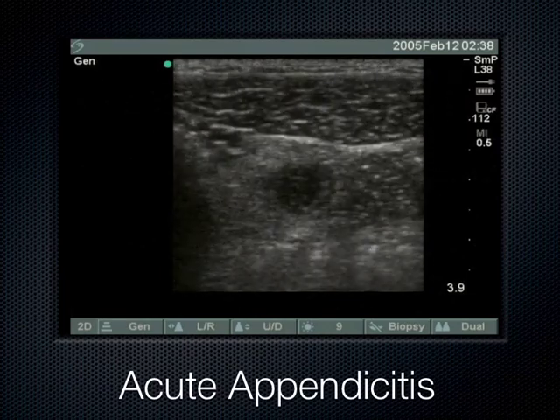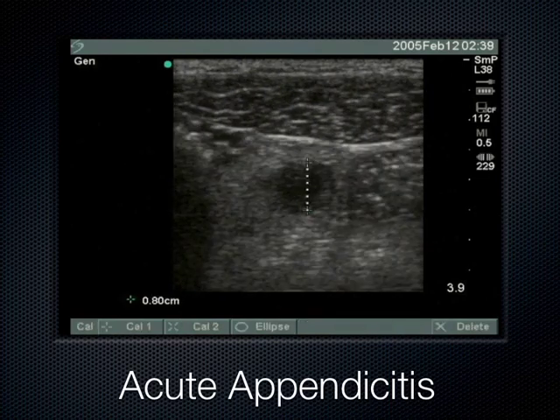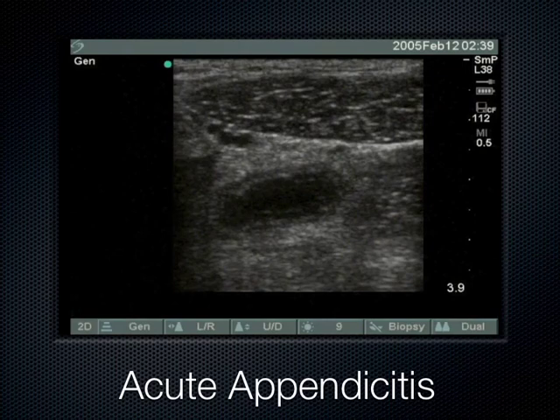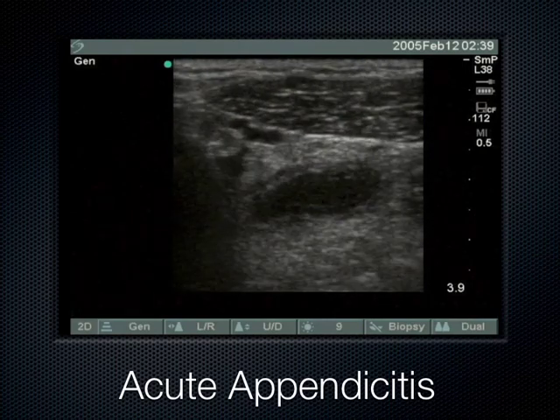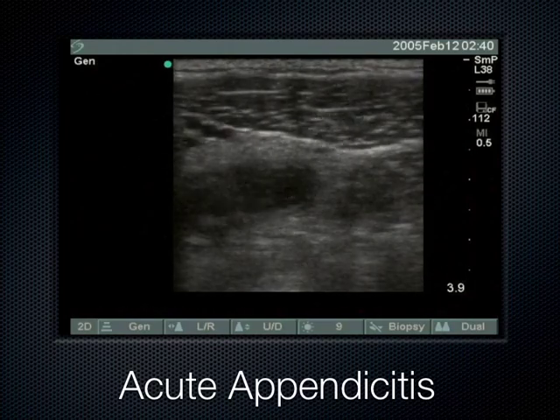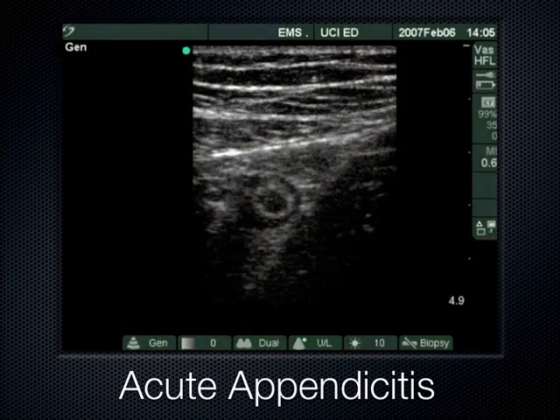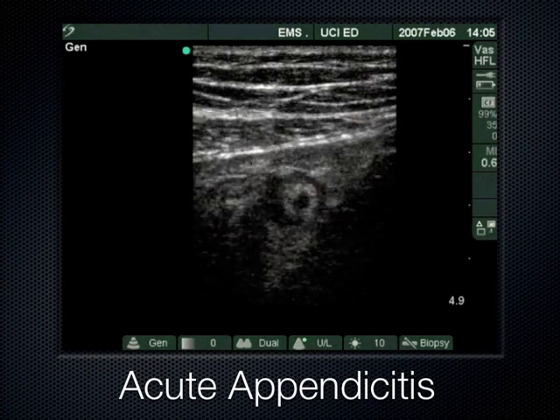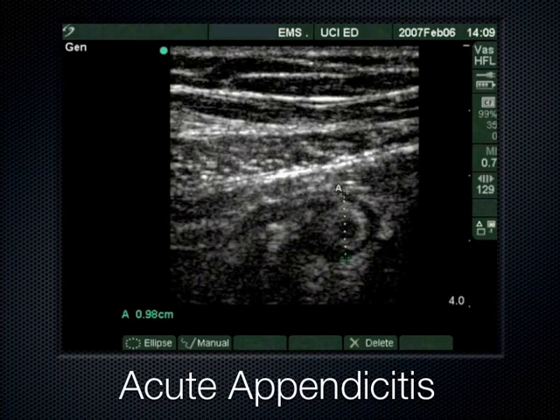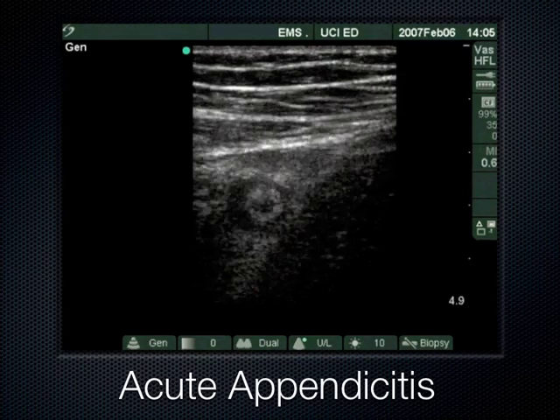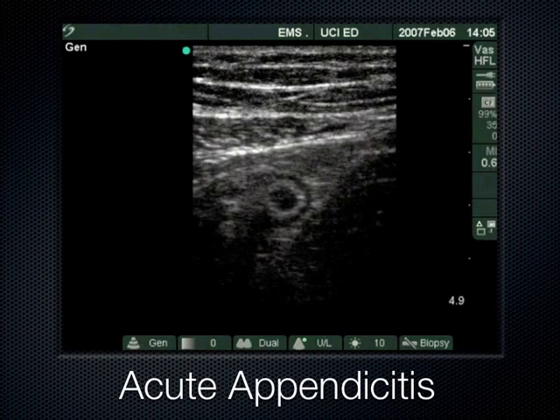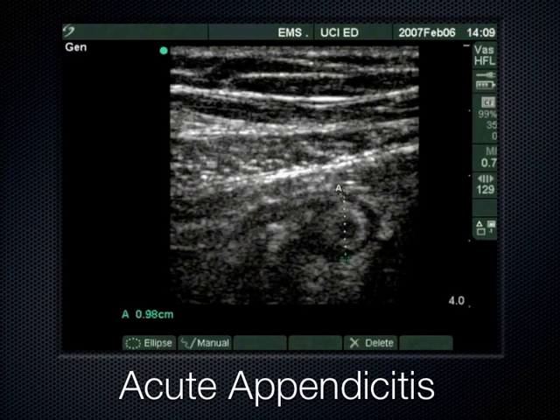This blind-ended tubular structure in the right lower quadrant, non-compressible, measuring 8 millimeters — that's true acute appendicitis. We're pushing and squishing the appendix up between psoas and abdominal wall musculature. When I do find the appendix, I feel so lucky — it's a magical moment. I'm really careful not to move the probe, and I rotate gently from transverse to sagittal to see it in both short and long axis.